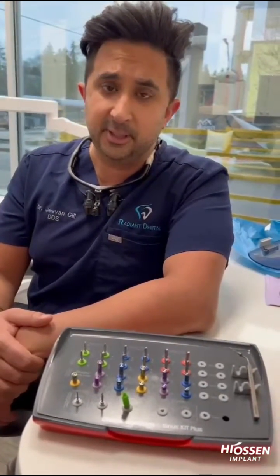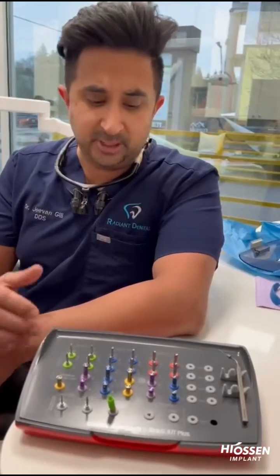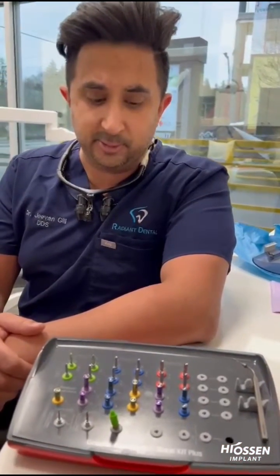It's a great kit to have in your armamentarium, especially when you're doing sinus lifts. Most of us, when we're doing these types of procedures, run into limited space vertically in the molars.